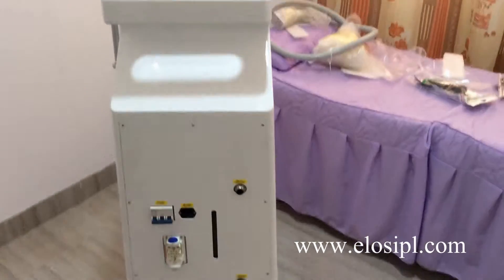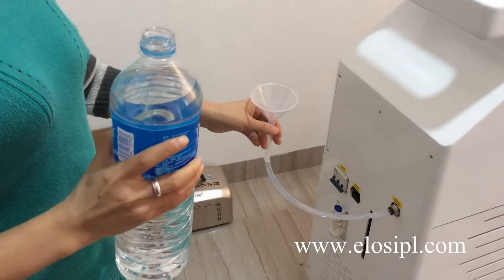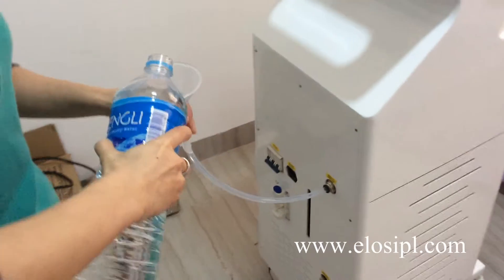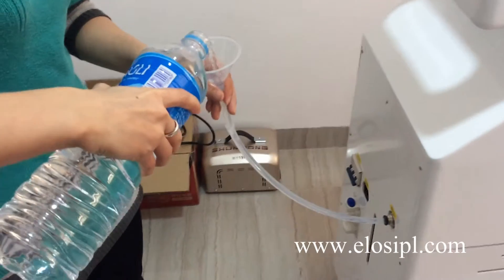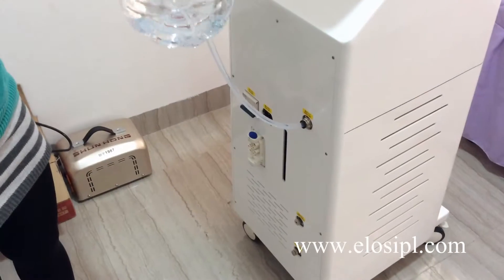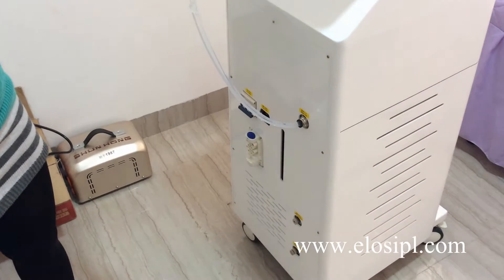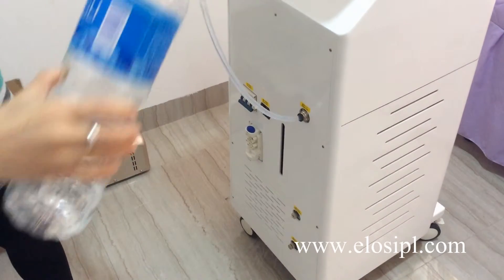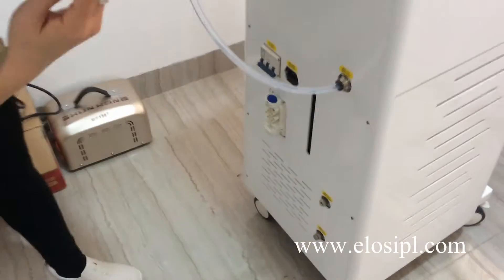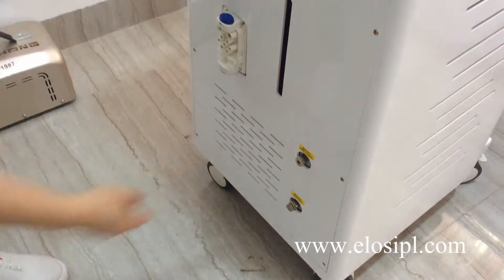Inject enough water into the machine. The water must be distilled water or purified water. When there is water flowing out from the water overflow hole, it means the water is enough.